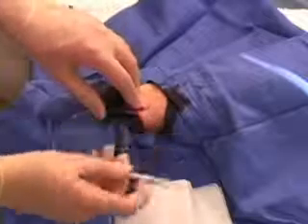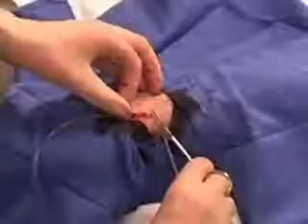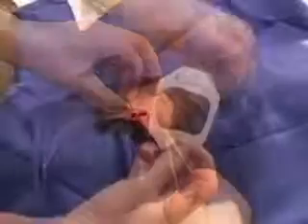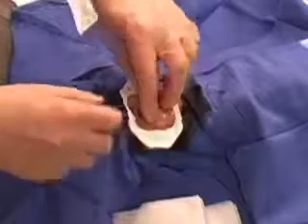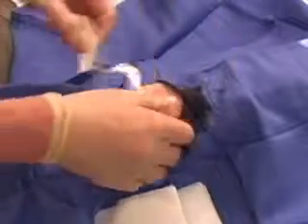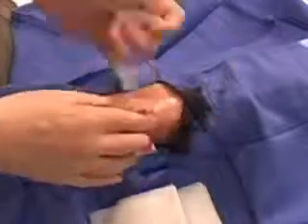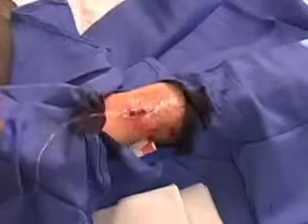Regardless of the technique used to place the catheter, great care should be taken to make sure it stays in place. Although there are ways to secure the catheter with adhesive tape, the best way is by suturing it in place. A moderate diameter, non-absorbable suture material such as silk or nylon should be used. The key is to make sure it is secure. A clear dressing can be placed over the catheter to help further secure it.